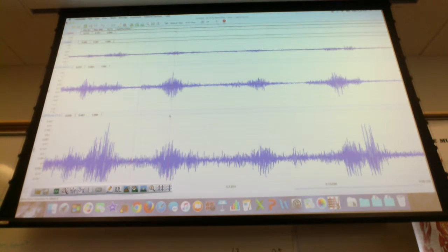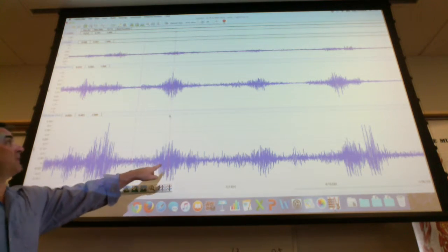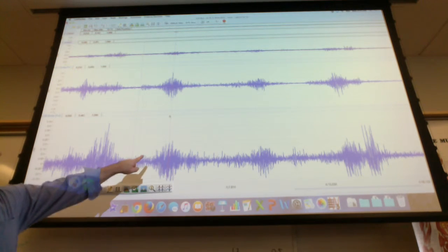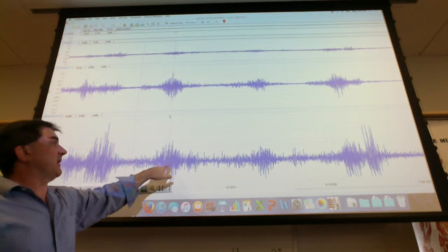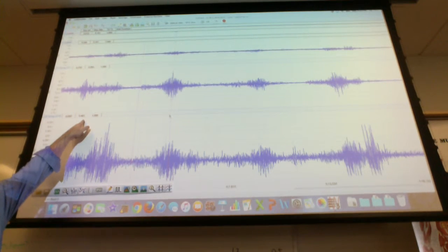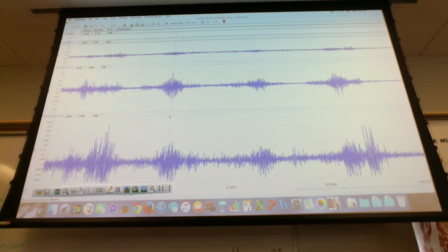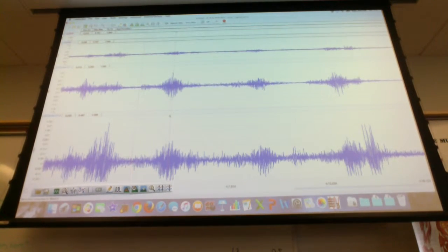Okay, so this is occurring during flexion, right? And the anterior muscle that we're measuring from is the bicep. At the exact same time, I can see what's going on in the lower recording, which represents what's going on in the tricep, because that line is exactly the same time in both these scales. So here I look and say, oh, the tricep is at 0.461. So we're in flexion, and the posterior EMG for that same time point, in this case for those guys, is 0.461.